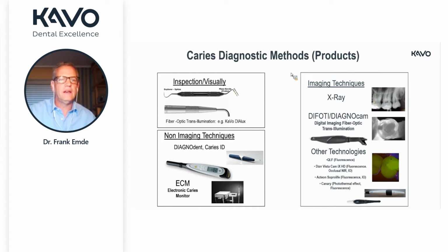And the second category you see below are something like non-imaging techniques or measuring techniques. In this category, I summed up devices which use different technologies, but you don't have something like documentation where you can see where you did the measurement. And last but not least, it is just the imaging techniques. In this category, we will discuss X-rays. We will discuss the diagnostic technology, which is the topic of today's webinar, and some other technologies like fluorescence or a combination of different technologies. What do we know about these different technologies?